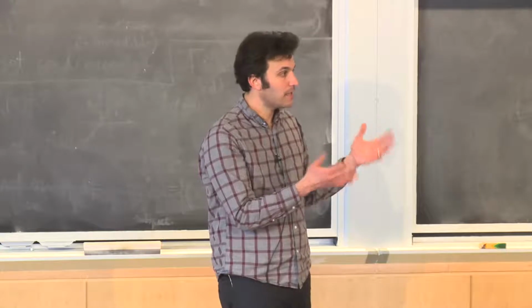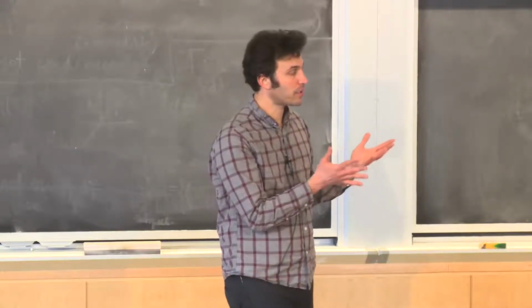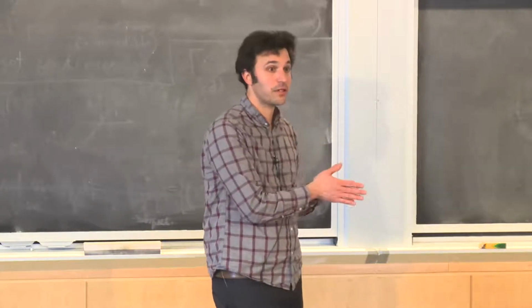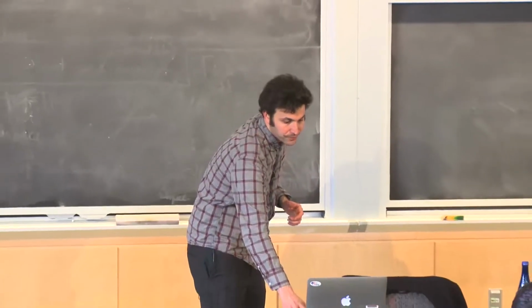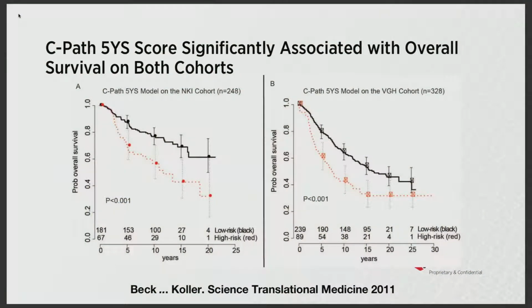And that sort of data is entirely inaccessible using traditional pathology approaches, and really required a machine learning approach to extract a bunch of features and let the data speak for itself in terms of which of those features is most important for survival. And in this study, we showed that these things are associated with survival. I don't know if you guys do a lot of Kaplan-Meier plots in here. We saw it once, but I think taking us through it slowly is never a bad idea.